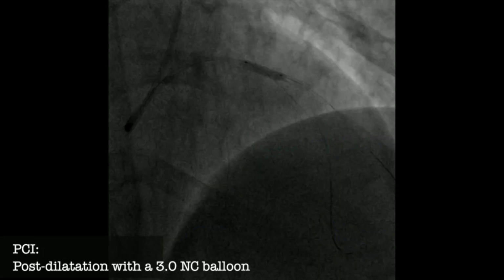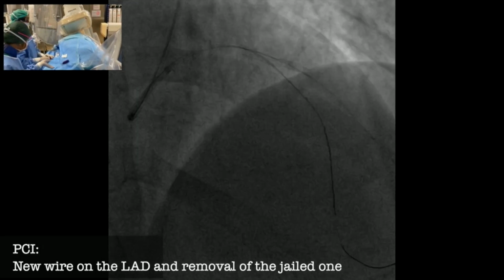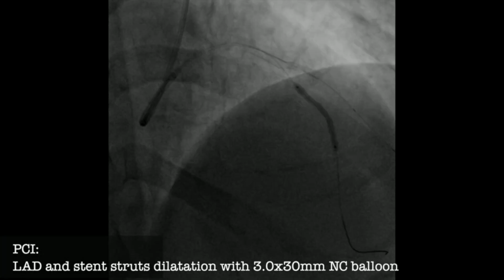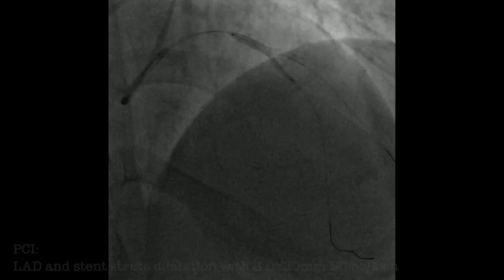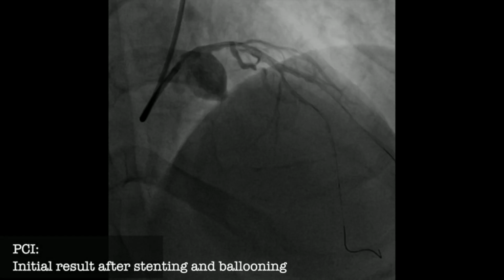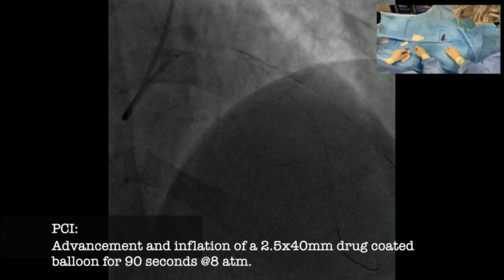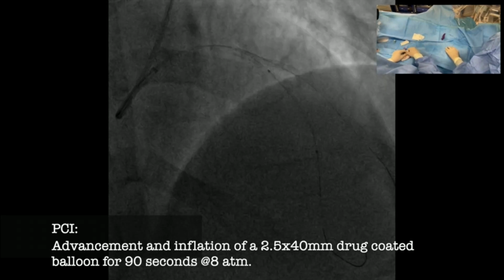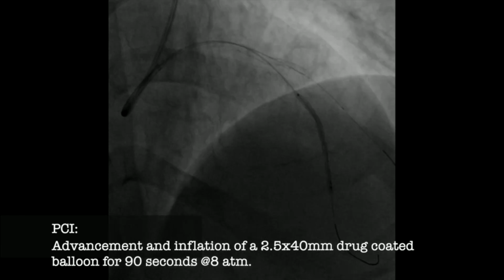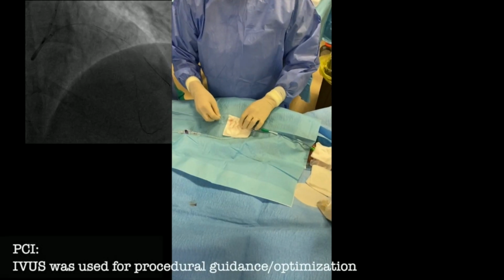It's just experience. So the first one is a stent 2.75, 26 millimeters long from the proximal LAD to the diagonal, and then it's jailing the wire, putting a second wire, and preparing the vessel quite aggressively with a semi-compliant balloon. And this is the initial result after one stent, which was planned. It's not a bailout. And then is vessel preparation and DCB treatment of all the distal and mid part of the LAD with a drug-coating balloon.